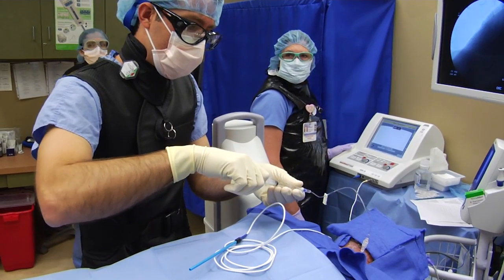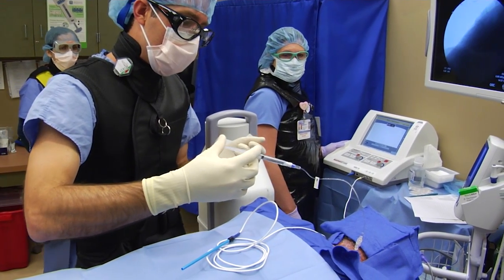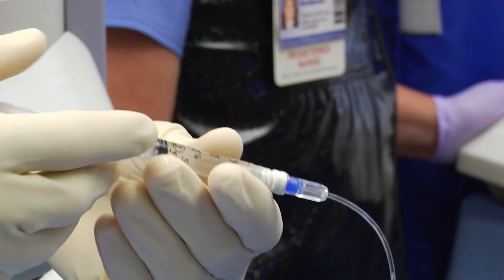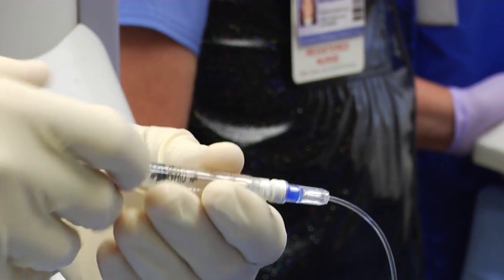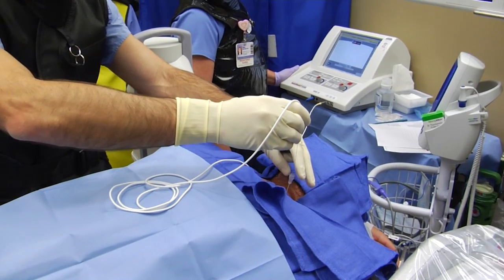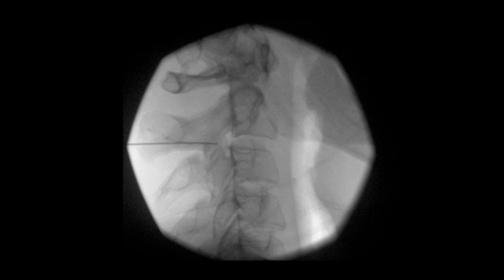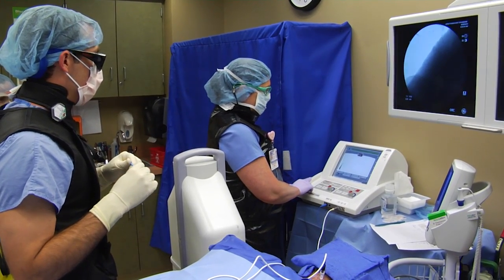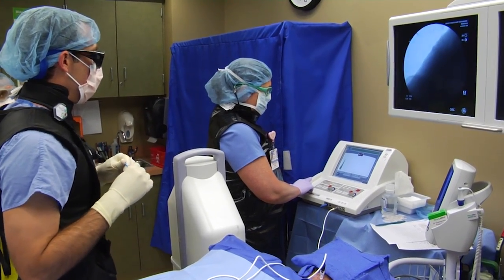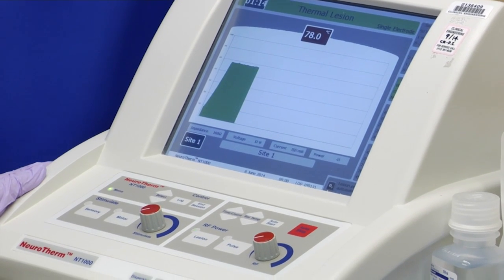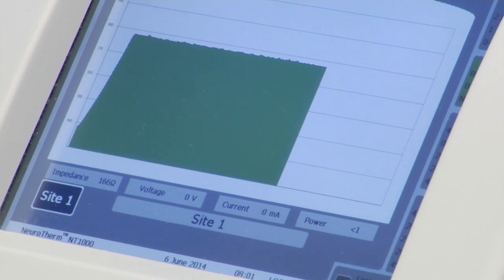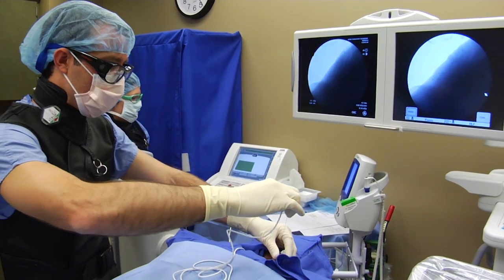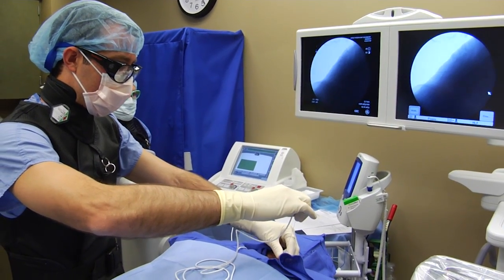At this point, I am injecting a 1 mL solution containing equal parts of 1% preservative-free lidocaine and 0.9% preservative-free normal saline to decrease the impedance and improve the ionic milieu in order to generate a larger radiofrequency lesion. The thermal lesion is created with a temperature of approximately 80 degrees Celsius being administered over 90 seconds. At this point, the needle tip is rotated approximately 180 degrees.